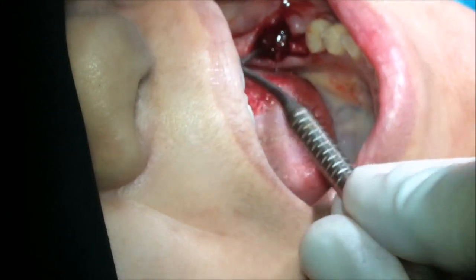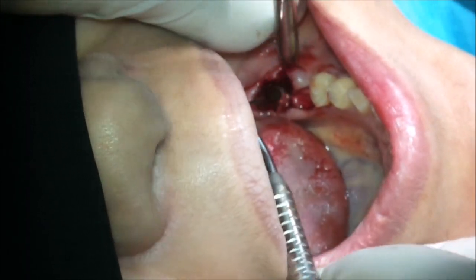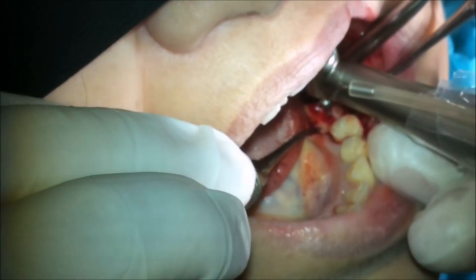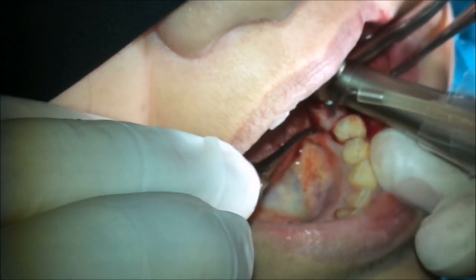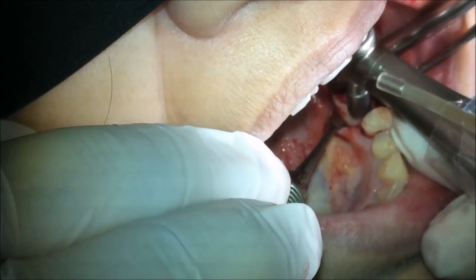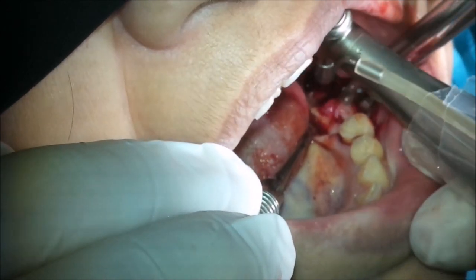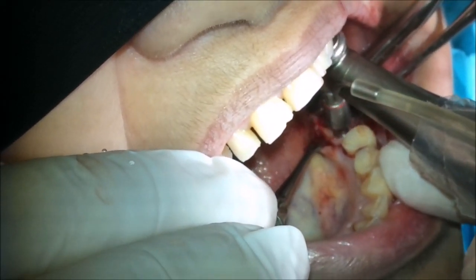According to the bone defect, you can decide either to put the implant at the bifurcation area using any method for bone expansion, or to put the implant at the mesial or the distal root area according to which has more bone around. The most important thing is that when you put the implant, you should have adequate initial stability.